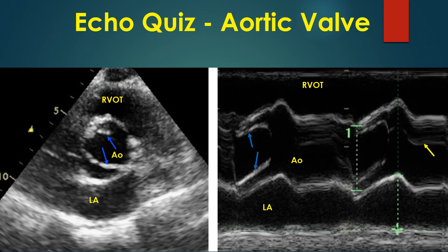The vertical axis on M-Mode is distance from the transducer. The horizontal axis is time — that is how it was called time motion mode, which was later shortened as M-Mode. Aortic leaflets in open position are marked by blue arrows. The aortic valve closure line is marked by the yellow arrow.